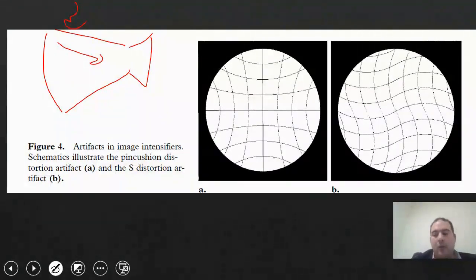Remember how we used to place our mobile phones next to our laptops and say that someone might call us because there were strains in the magnetic field and we started to hear interference? Any device that conducts electricity has a magnetic field. Now, this magnetic field will affect the movement of electrons.